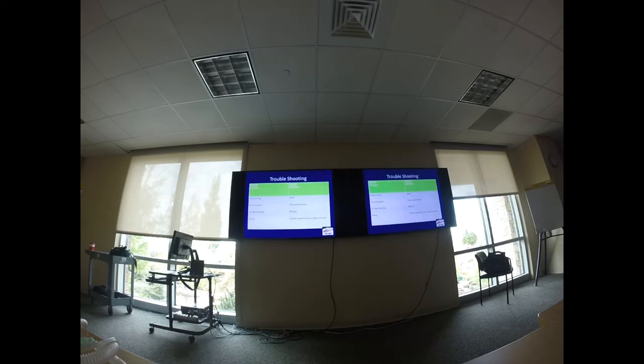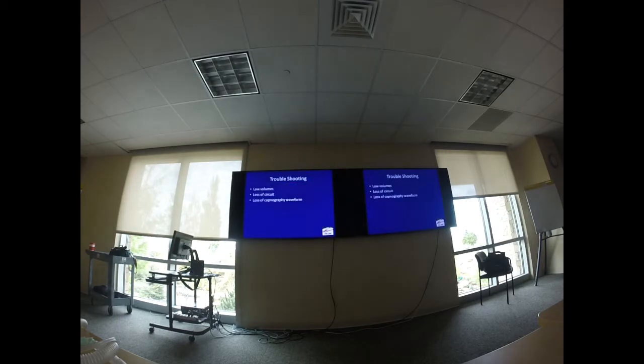So you guys, again, this is why I really want you to check your P-plat. And your P-plat is not just magic on your ventilator. It doesn't just show up. So you have to check it. But you can see where if my peak inspiratory pressure is alarming, 45, 45, 45, I could have a patient with ARDS and not recognize it. Probably the dude's super sick, but let's say he's pulmonary edema, right? I don't recognize it because I never checked my plat, right? So I ask you guys if you wouldn't mind checking both.